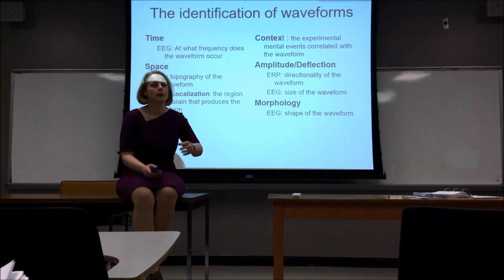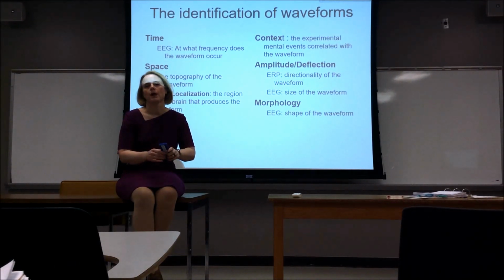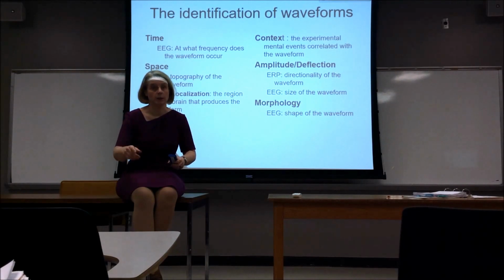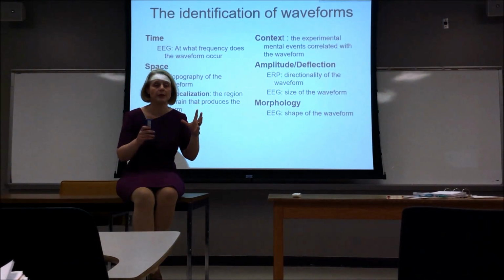People come into my lab, they will have their eyes open, they will tell me they're perfectly fine. And they're into the study and somehow they're still responding. I don't know how they're doing it. And I am registering delta. That's a waveform associated with deep sleep. And so that tells me a lot about context, and it's very regular. It's a phenomenon I've observed for many years.